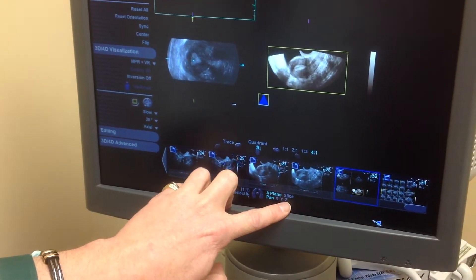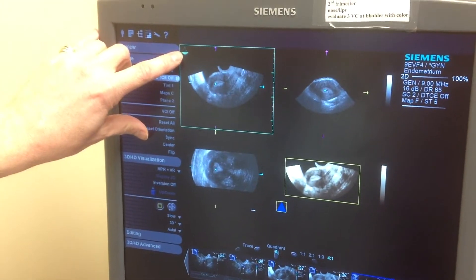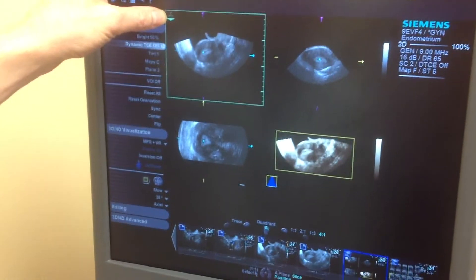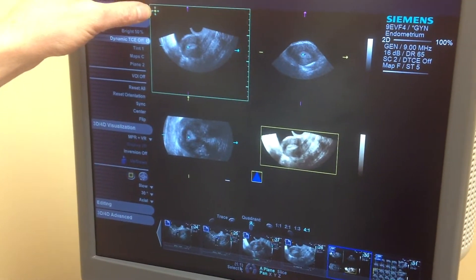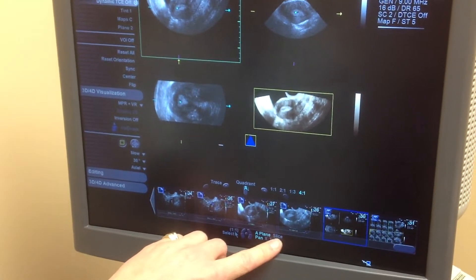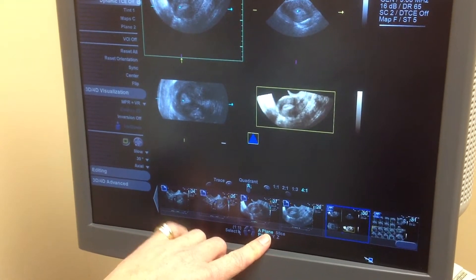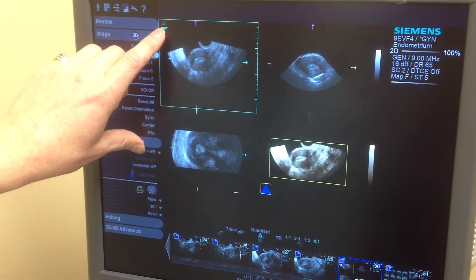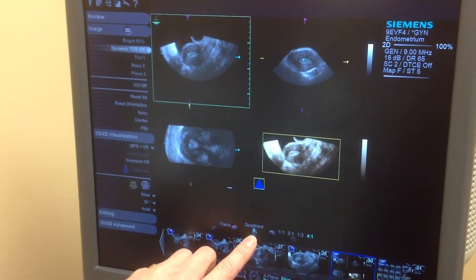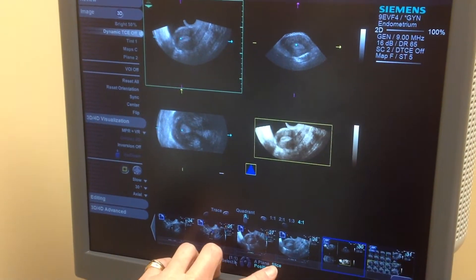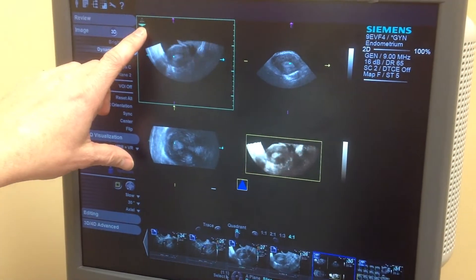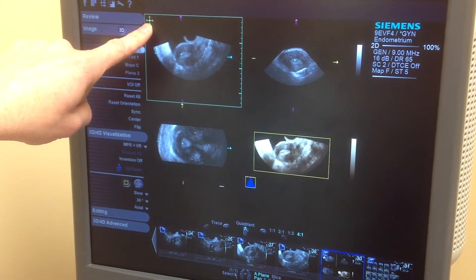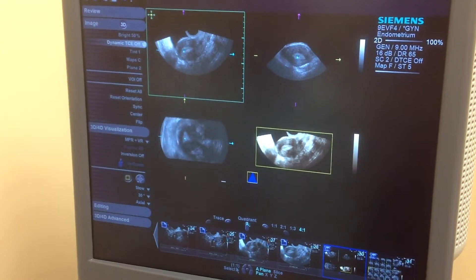The next key would do X, Y, and Z. When on the priority key, the trackball goes through slices. If I hit the priority key again, I go back to the pan function — so the priority key toggles between slice and pan. You can also go to slice by hitting the thumb wheel in or by hitting the priority key, allowing you to go through slices to find the midline. Then go back to pan to move your reference dot.